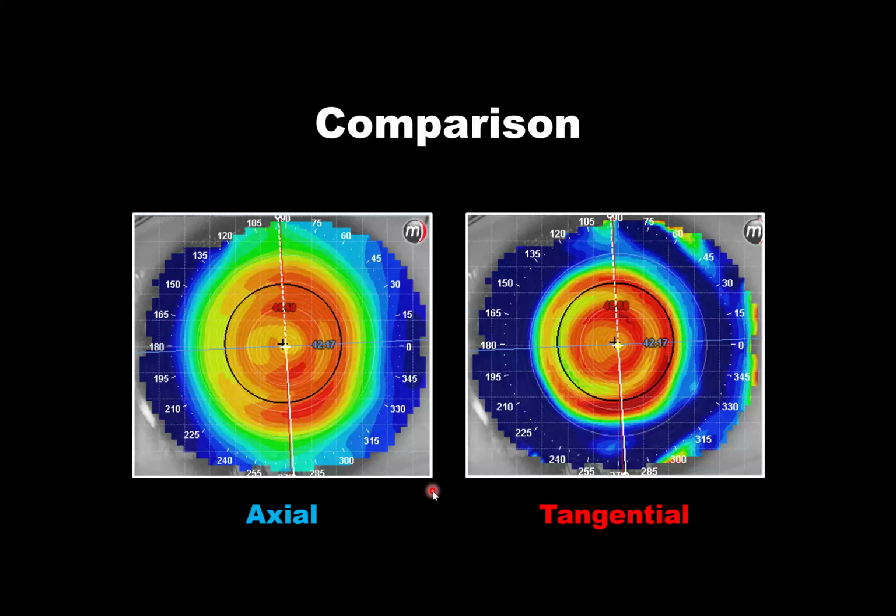Obviamente el axial, encima del lente de contacto, nos va a dar una idea de lo que estamos viendo, pero el tangencial, al ser mucho más específico, crea un mapa mucho mejor en términos de lo que está pasando, la localización y cómo se reparte esas áreas de poder en ese lente. Y obviamente con respecto a la pupila.